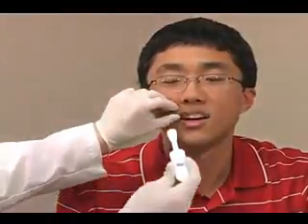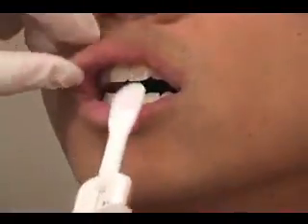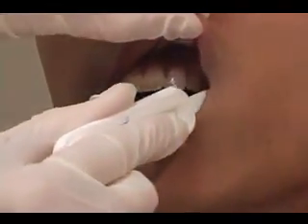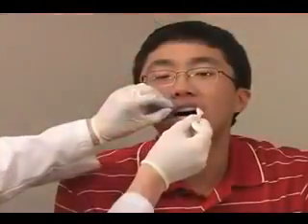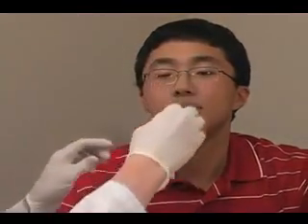Place the flat pad above the patient's teeth against the outer gum. Gently swab completely around the outer gums, both the upper and lower, one at a time using the flat pad. Do not swab the roof of the mouth, inside of the cheek, or tongue. Both sides of the flat pad may be used in this procedure.